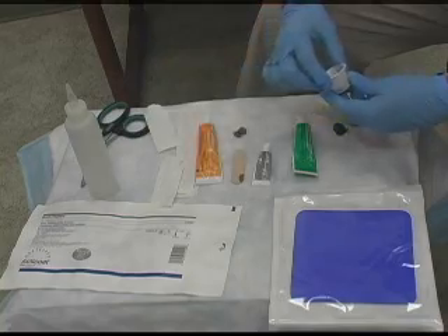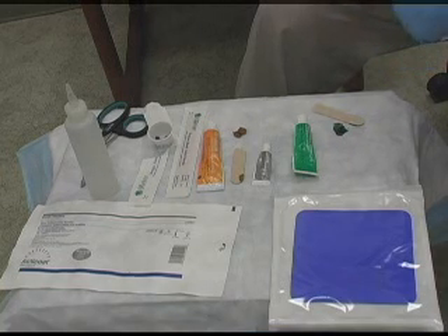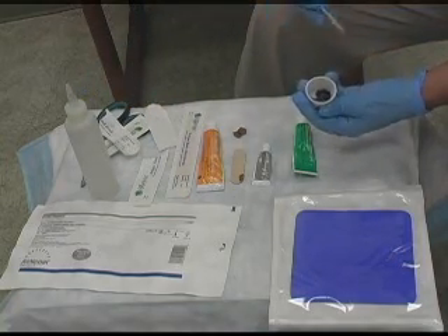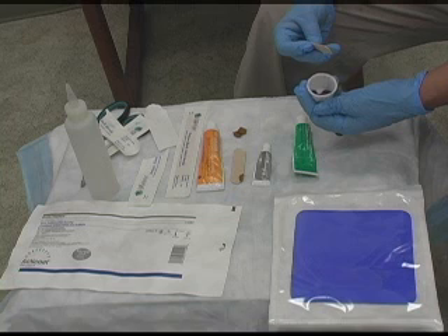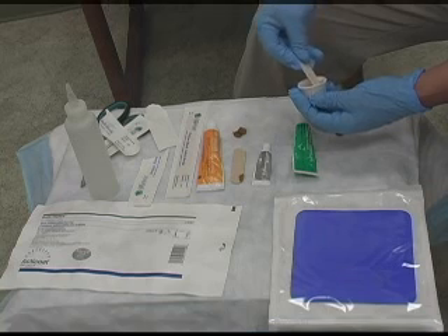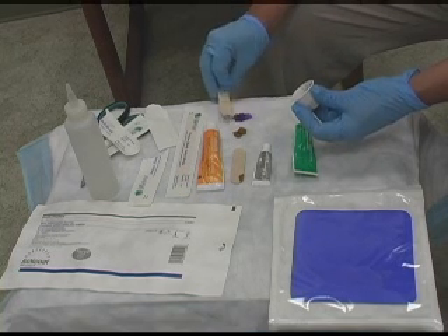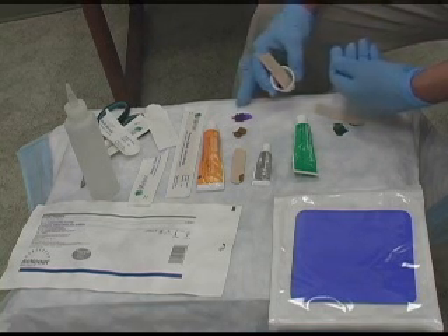One of the products that we have here in our clinic is called ABA, and it is an antibacterial biofilm agent. We use it on wounds that have already been debrided. What it does is it keeps biofilm from actually forming back on the wound bed, and it allows the healing process to begin. If you'll notice, it's a nice pretty purple. What you want to do with this is just apply a thin layer over the wound bed and cover it with your foam, whatever foam that you use in your practice.